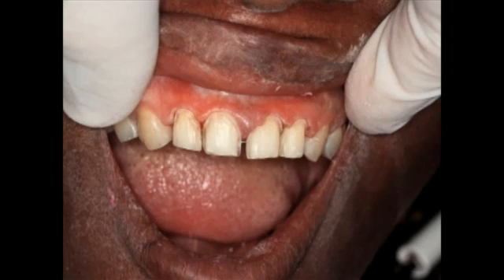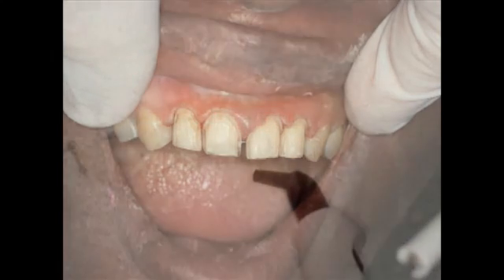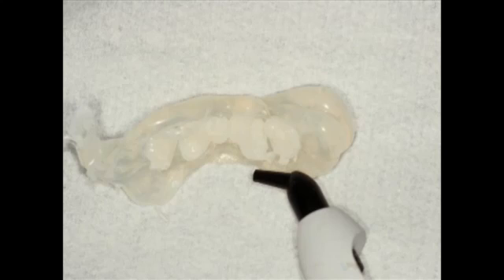So we prepped the teeth, and this is nothing special. We prepped the teeth for porcelain laminate veneers. We did the 4 anterior maxillary teeth. We took an impression the way you normally do. And now this patient wants to look perfect when she leaves today. So what would you do in a case like this? Let me show you what I did.